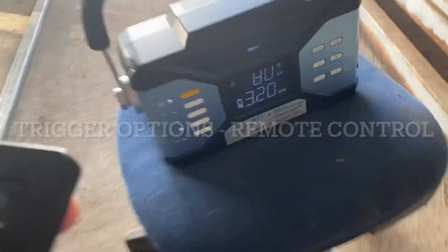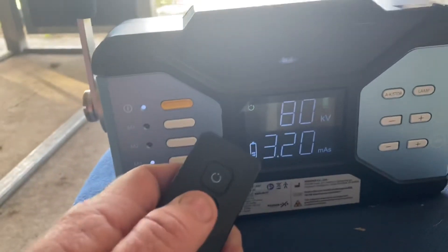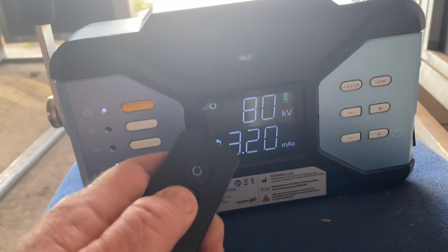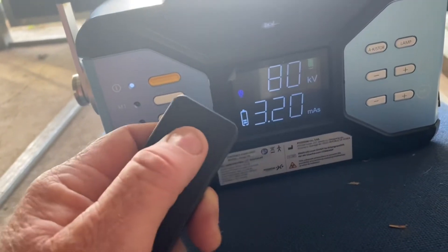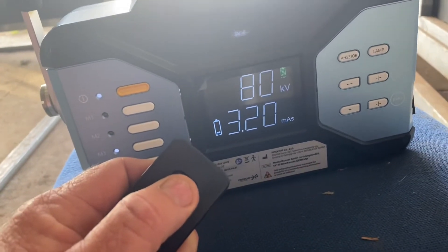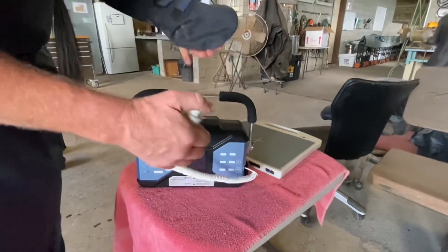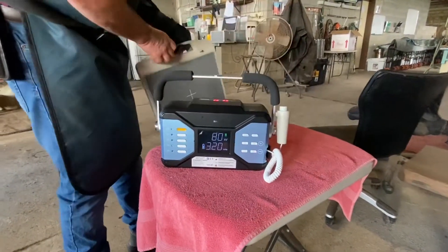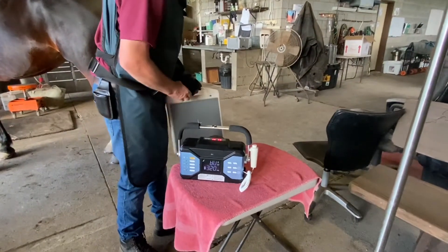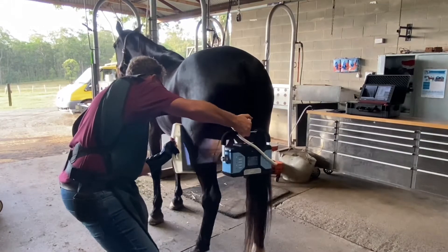You can use this remote control button to initiate the shot. It tells you the machine is ready, then you press the fire button when that light is on — you only have about a second after pressing the initiating button. We can also use the plug-in hand switch here, where you just plug it in and it's ready to go.